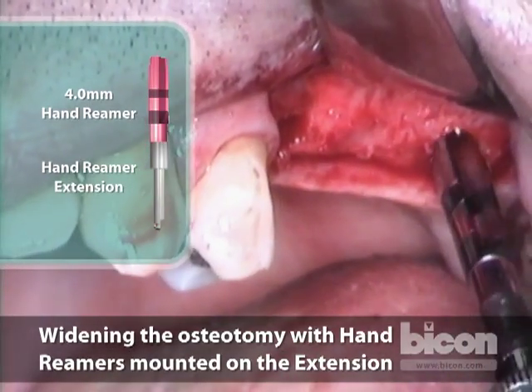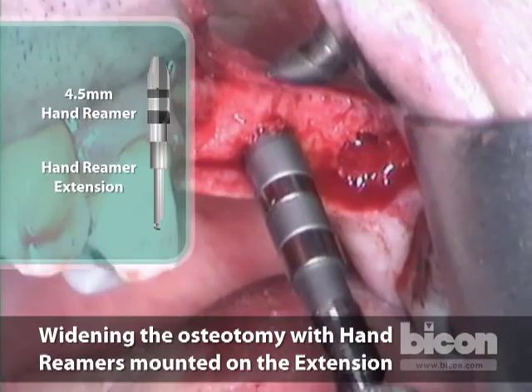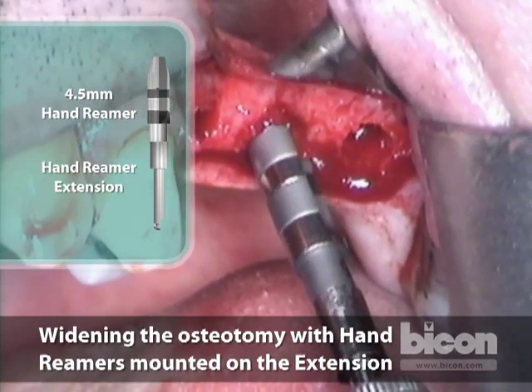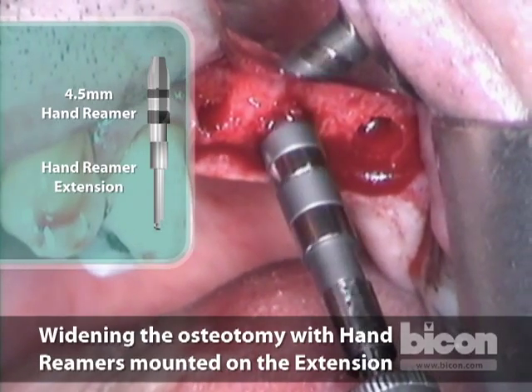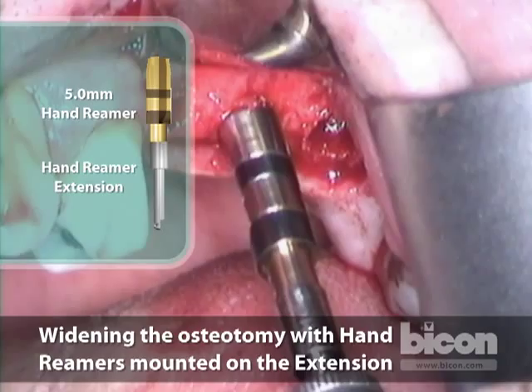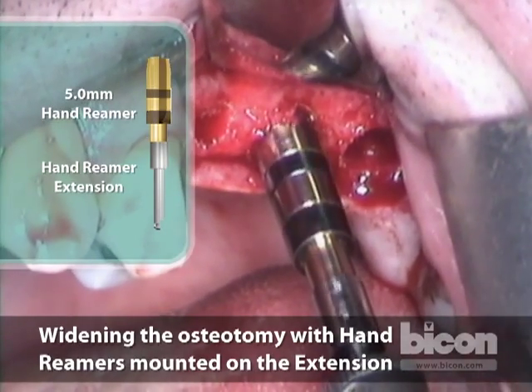The third osteotomy, which is for the second molar, has a lot of width, so I will try to go to a 6x5mm implant. This will show the use of all 5mm-long implants available. I like to get to as wide an implant as possible — the length matters less, but if you can get it wider, why not?